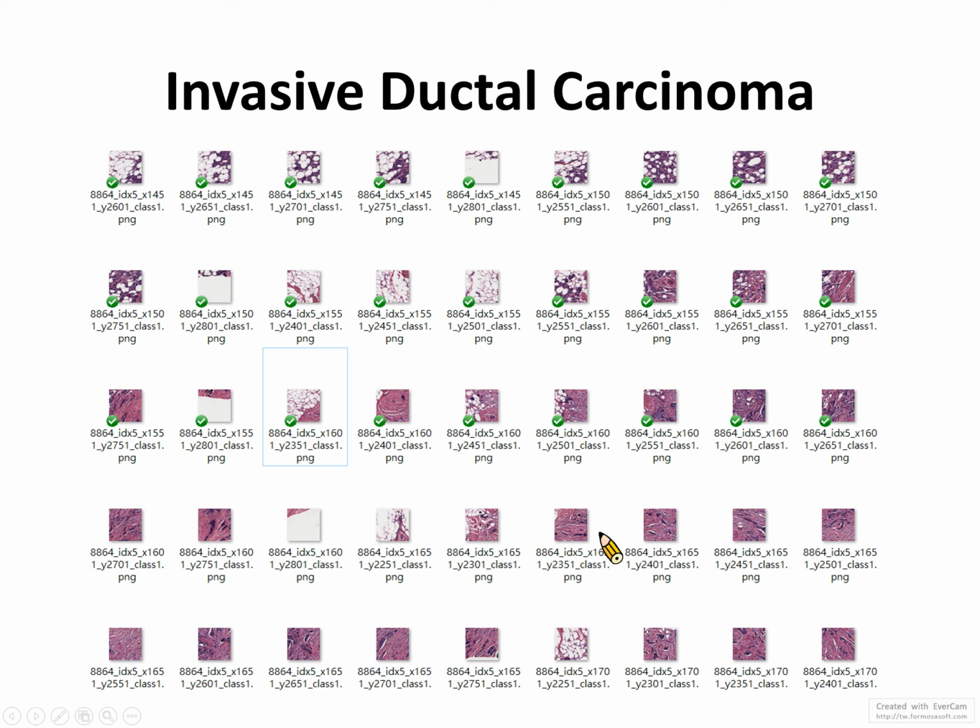So for this 1,000 versus 1,000 data set, it's still very difficult using conventional methods, for example logistic regression, to do the machine learning, because for logistic regression you need to derive some image features from this data, but it's not easy to derive useful features.